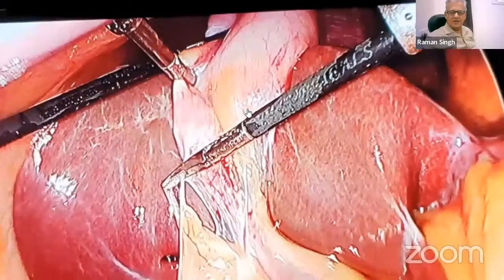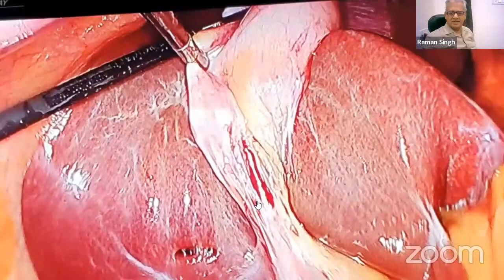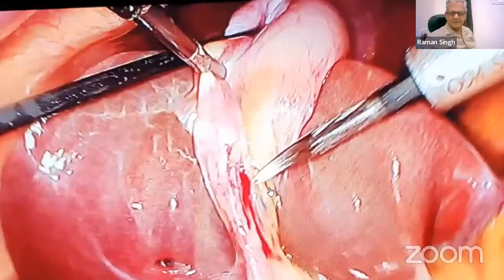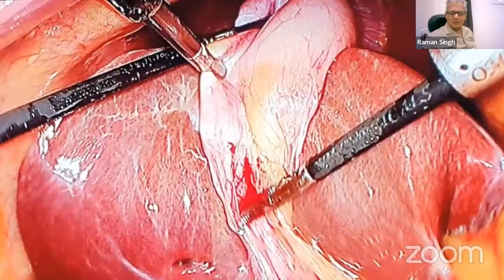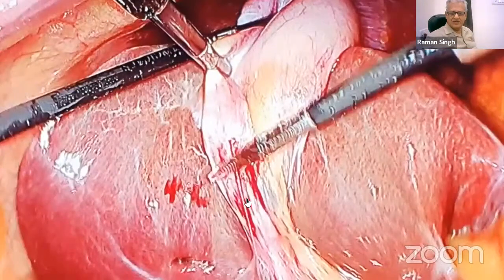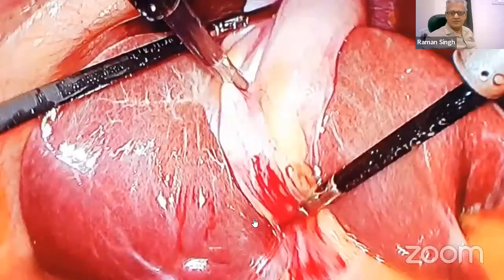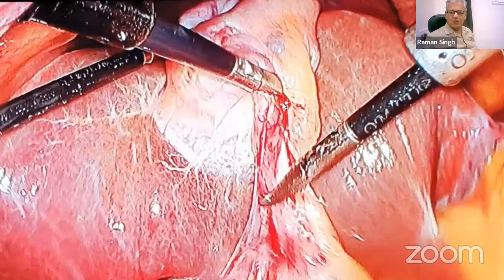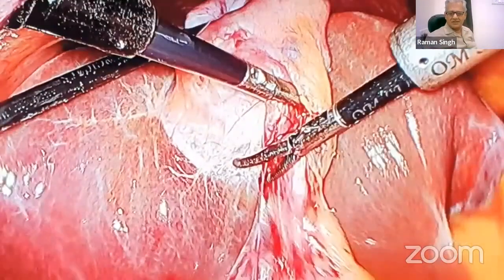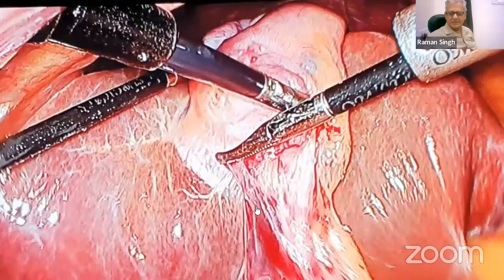After emptying the gallbladder, grasping the gallbladder becomes easier. Now we start dissecting the cystic duct and cystic artery. It is better to remove the attachment posterior to the gallbladder, and this infundibulum becomes loose, and we go up beyond this common bile duct, which is just below that.